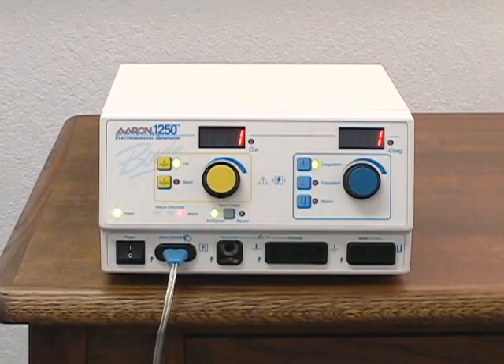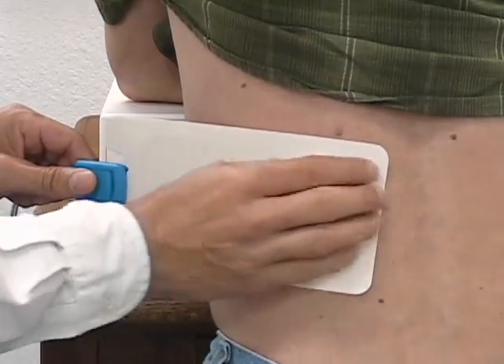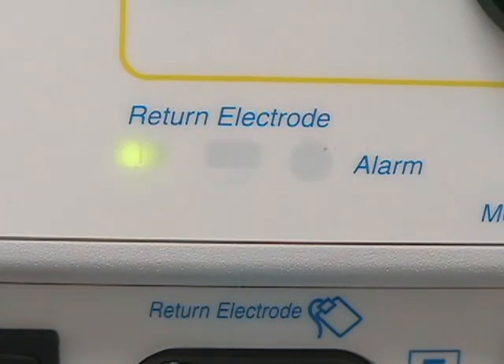You will notice that the return electrode alarm indicator is still illuminated. This is due to Bovie's NEM pad sensing technology. Once the pad is securely attached to the patient, the alarm light will go out and the split pad icon will be lit.